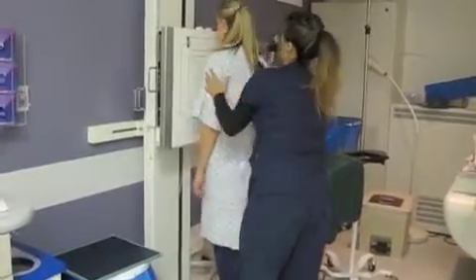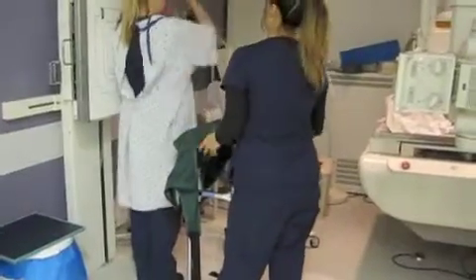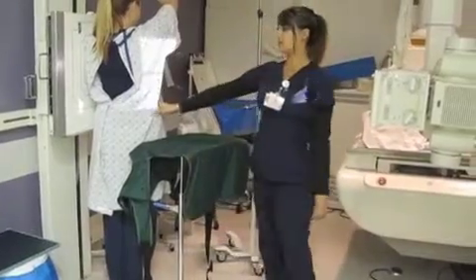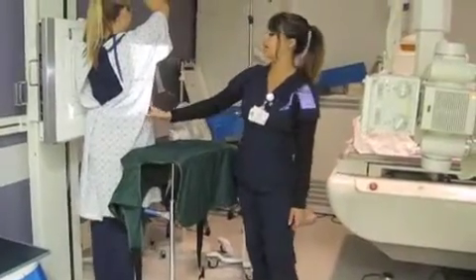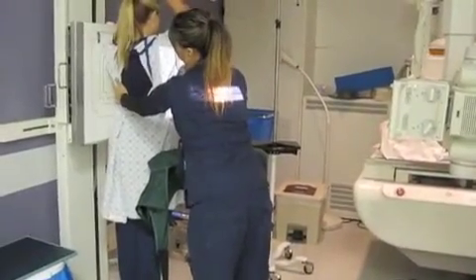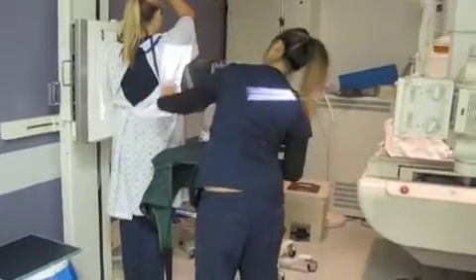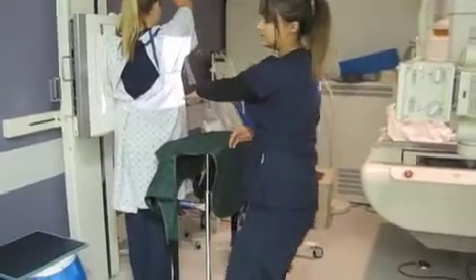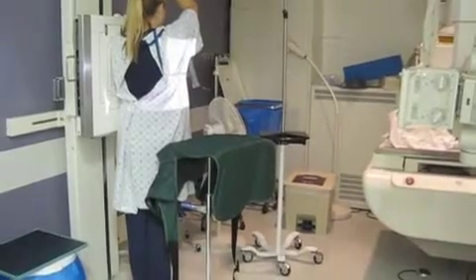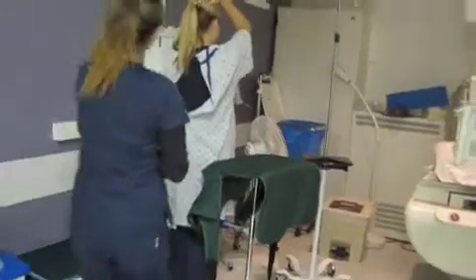So I'm going to go ahead and turn your face this way, up against the board. And go ahead and put your hands on top of your head. Alright. And once again, the light is centered, mid-sagittal plane parallel to the IR. I'm going to make sure her back is straight. I'm going to kind of rotate it just a bit to make sure the vertebrae are superimposed. Just a slight rotation. Right, and once again, we center at the level of T7. Alright, go ahead and hold still and take in a deep breath. Hold it in. Beep. Breathe. You can go ahead and relax.